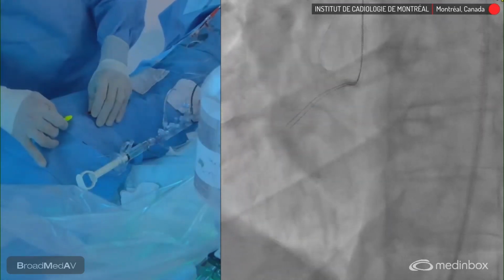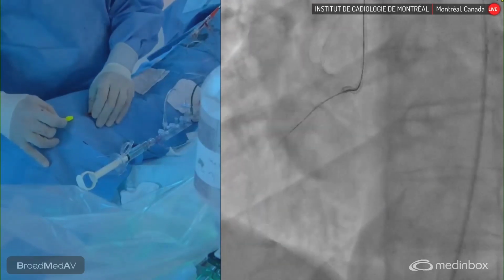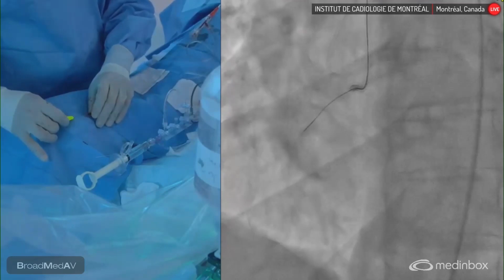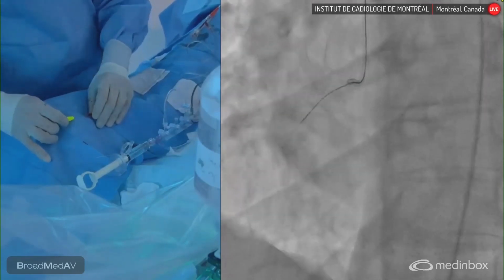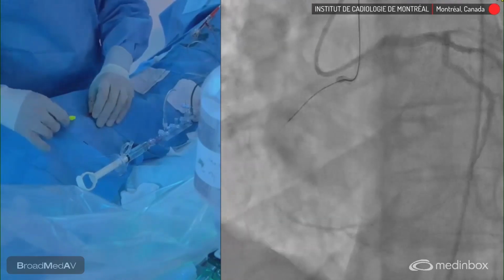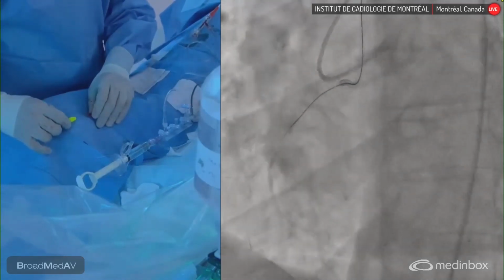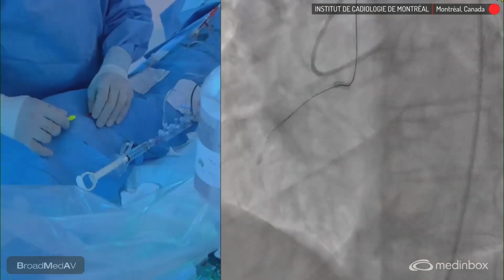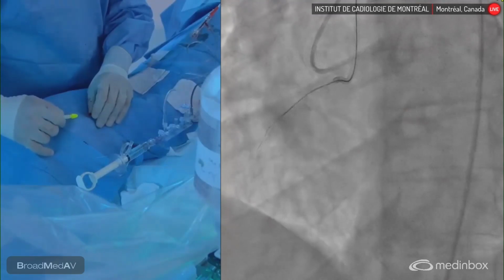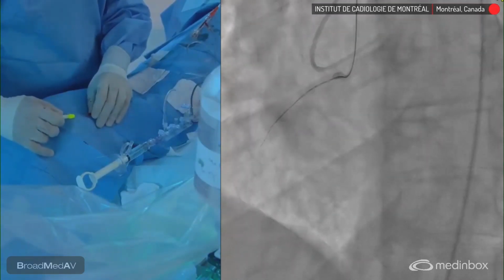And we purposefully have 2 setups to distinguish both catheters. So if we're going to do injections from the left system, it's going to be through the automatic injector. And if we're going to do manual injections, they will be through the RCA catheter. So if we look, the XT looks like it took a microchannel and it's progressing. I think this is subintimal at this point.